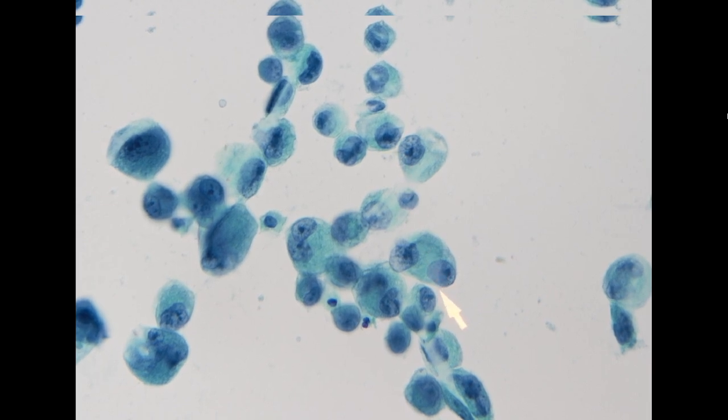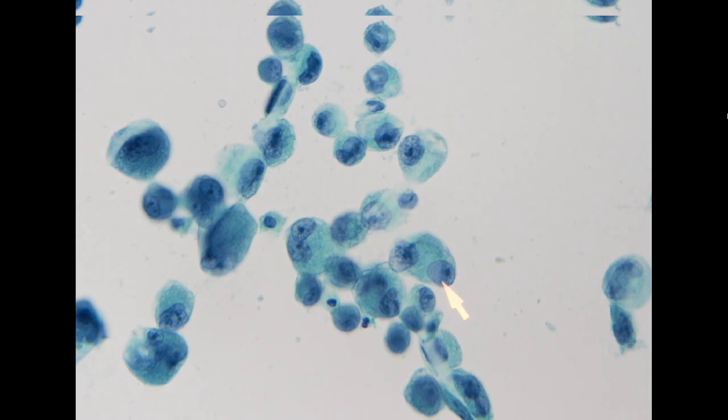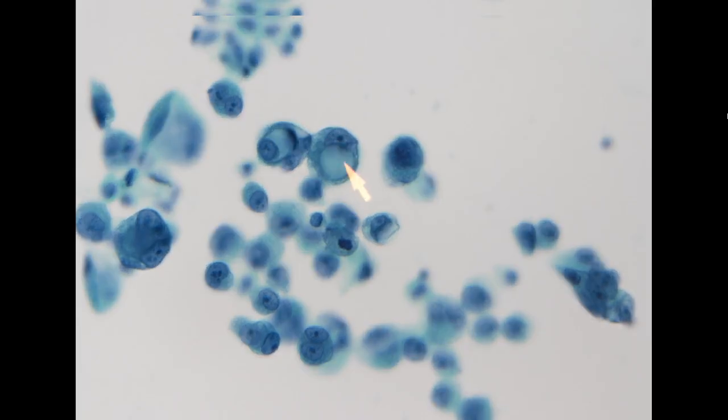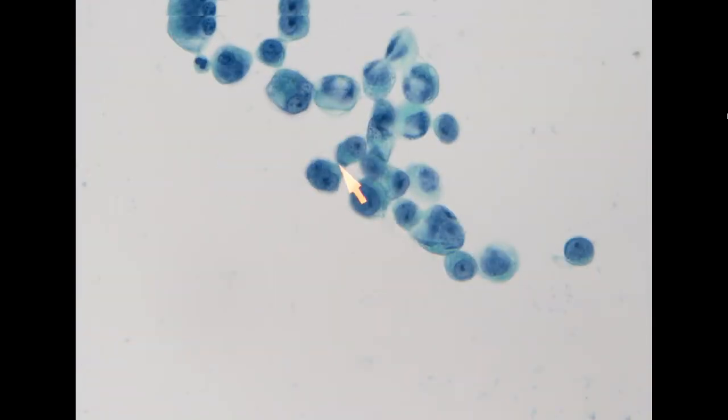Because this has already been treated, for this case it doesn't form very well organized aggregates or glandular structures, but it shows prominent individual cells, suggesting that this is poorly differentiated. But when you take a look at the cell, you can still see the vacuolation in the cytoplasm pushing the nucleus to one side of the cell.